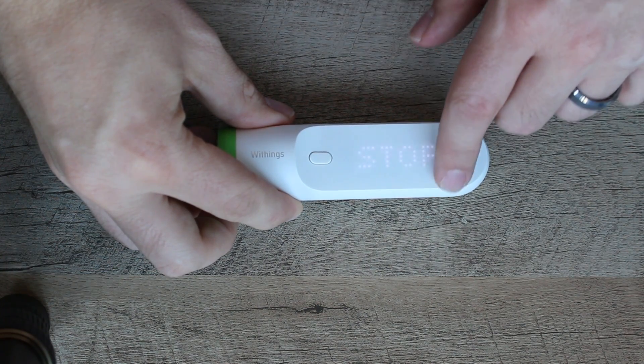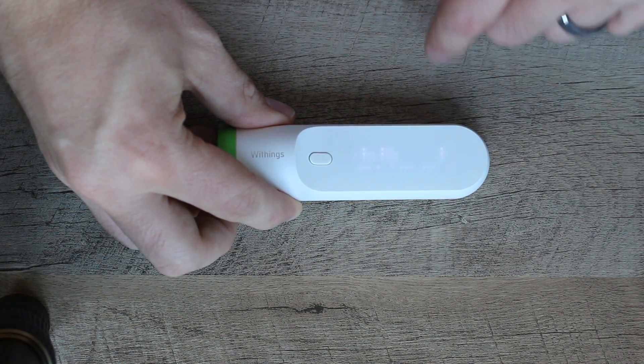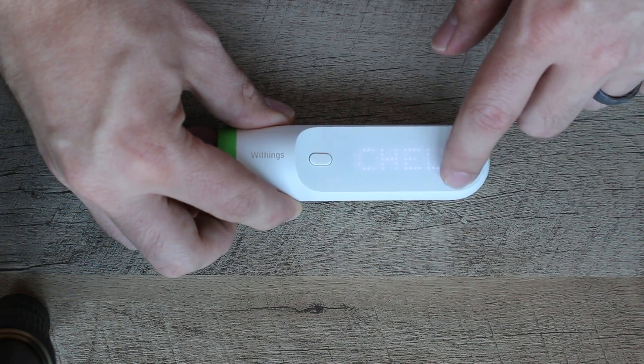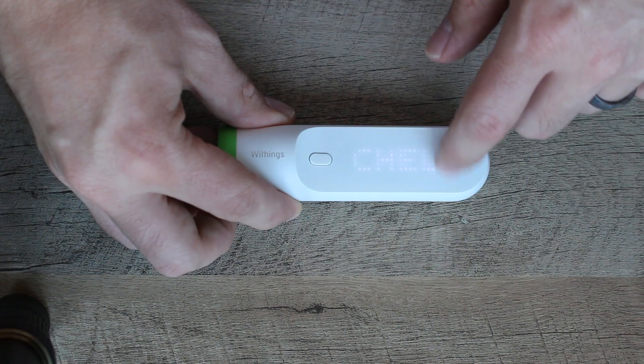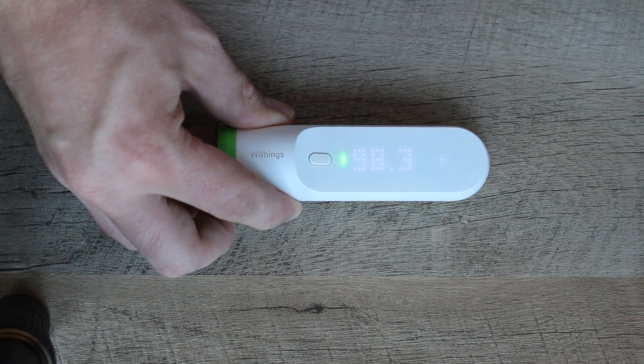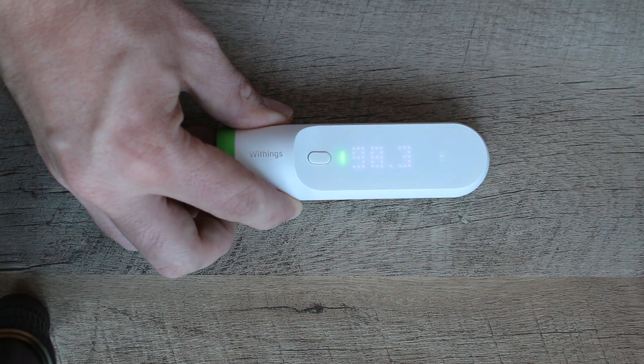As soon as it vibrates it means it's done, and it says my temperature right now is 97.2. The other cool thing about this is there's an application. I've set up the Thermo to not only work with myself but also my wife, and I can swipe through the names that are on here and say the temperature I just took is for me, and push this button right here — it'll save that temperature and upload it into the app.